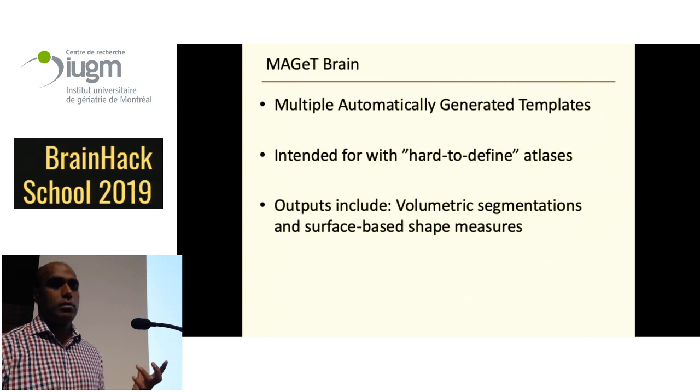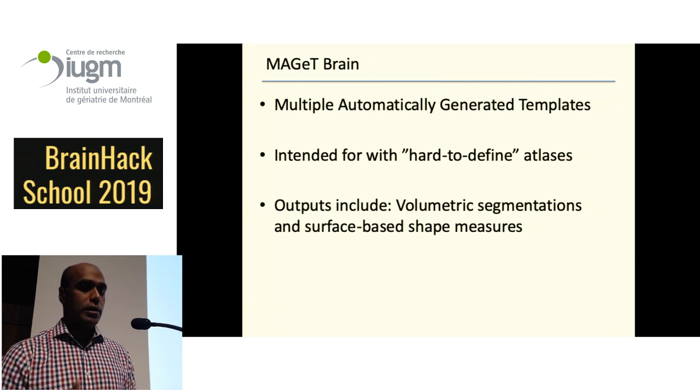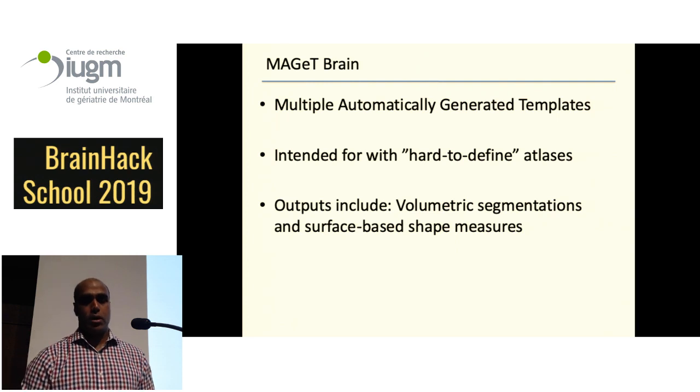It's intended for hard to define atlases and hard to define segmentations, and I'll explain what that is in a little bit. And the outputs include volumetric segmentations and surface-based shape measures.